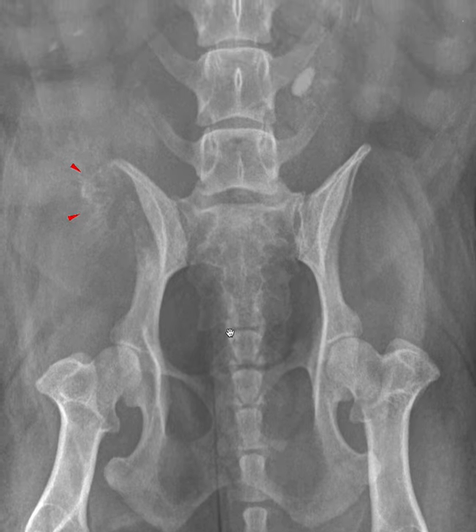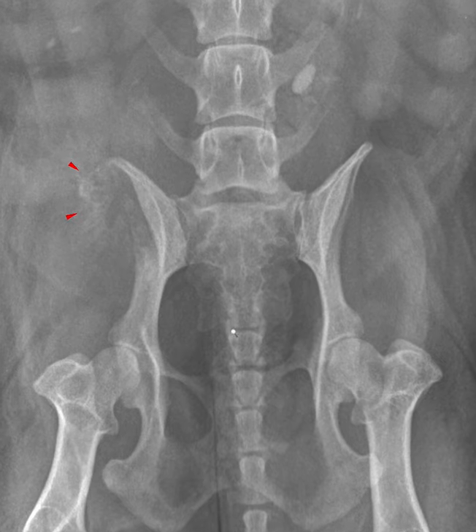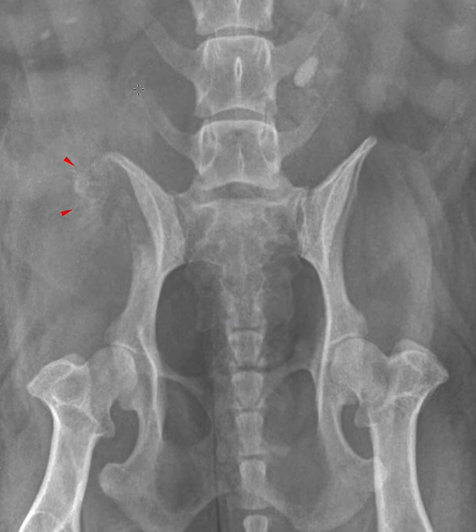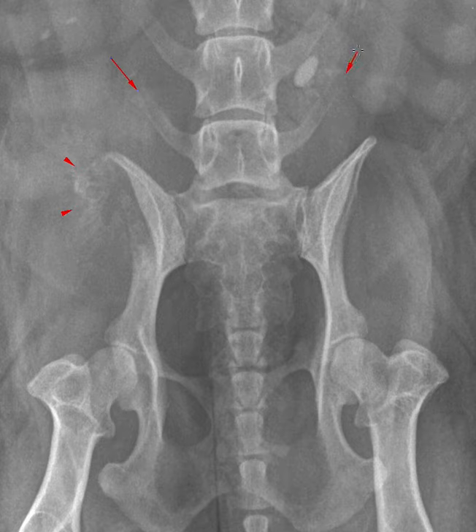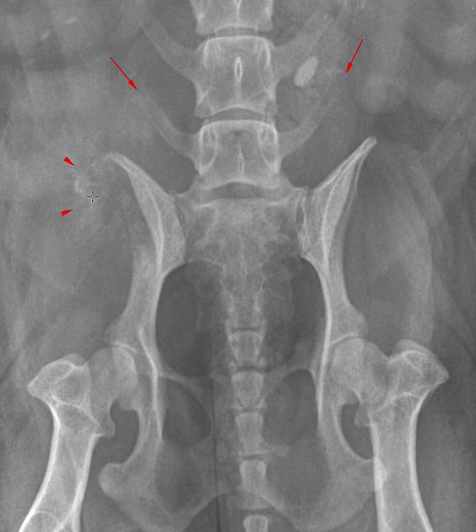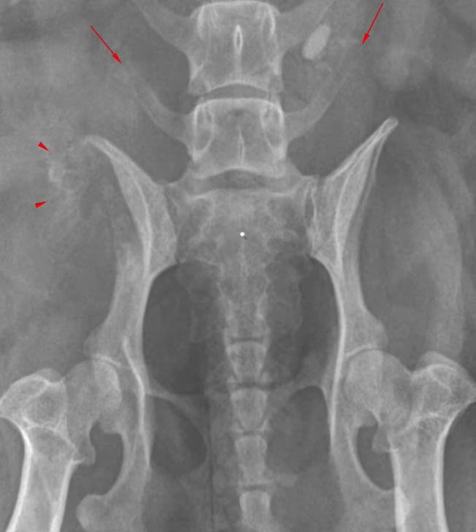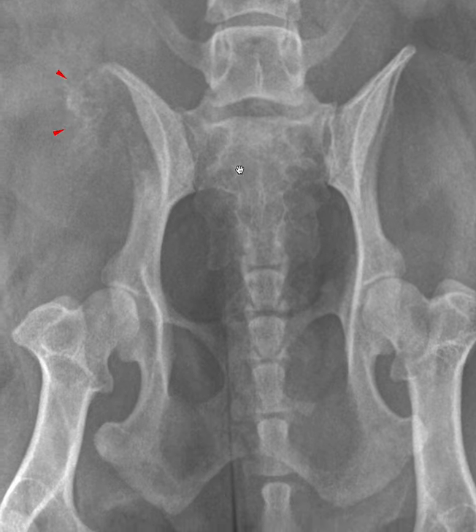I want to share an area where I had some interpretive difficulty. I wondered if the transverse process of L7 was a little bit more lucent than expected, and whether a soft tissue mass could affect both locations. But on comparison, I didn't think the transverse process looked substantially different from the opposite side. I also think if this were a primary soft tissue neoplasm spanning these two spaces, the other edge of the ilium would be more affected. I share that to give you some insight into the interpretive challenges I encounter when looking at radiographs.